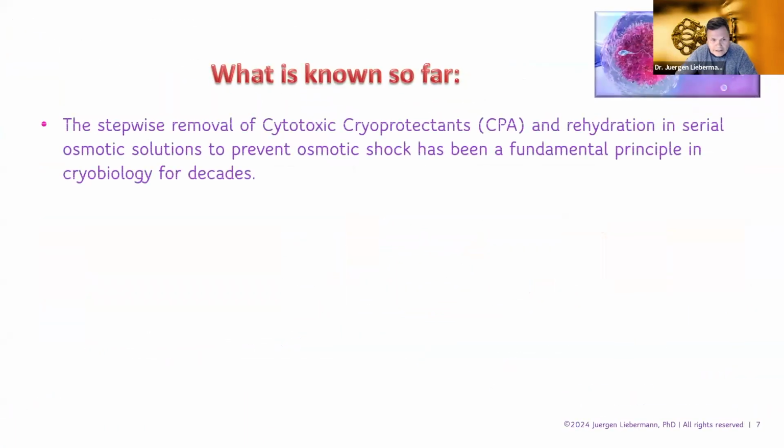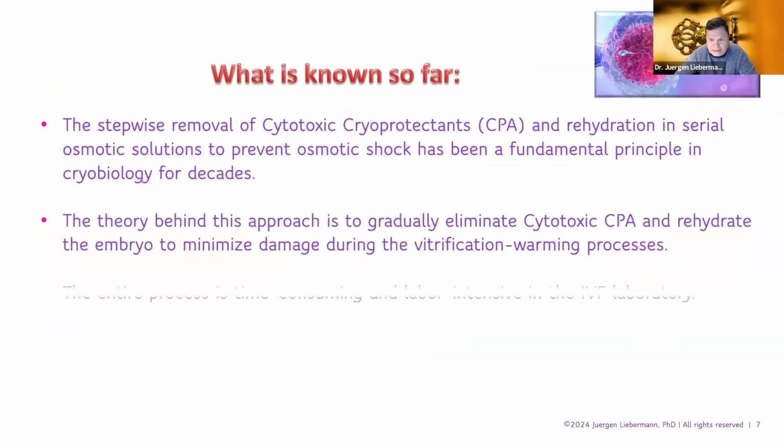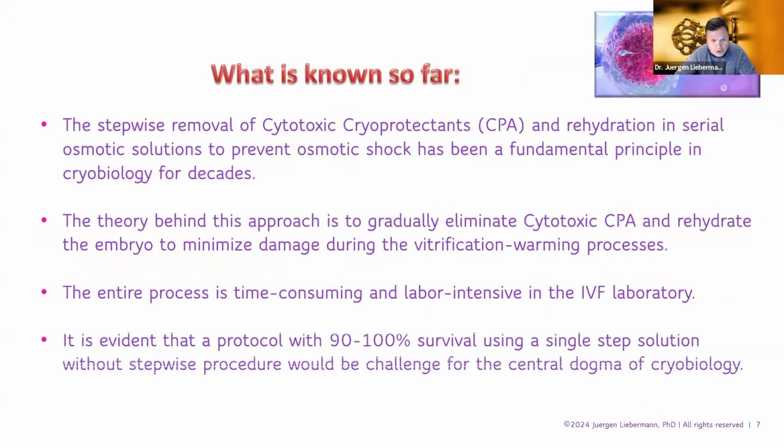What we know so far is that a stepwise removal of the cryoprotectant and rehydration in serial osmotic solutions to prevent osmotic shock has been a fundamental principle in cryobiology for decades. The theory behind this approach is to gradually eliminate the cryoprotectant and rehydrate the embryo to minimize damage during the vitrification and warming processes. The entire process is time-consuming and labor-intensive in each IVF laboratory. It is evident that a protocol with 90 to 100% survival using a single-step solution without a stepwise procedure would challenge the central dogma of cryobiology.